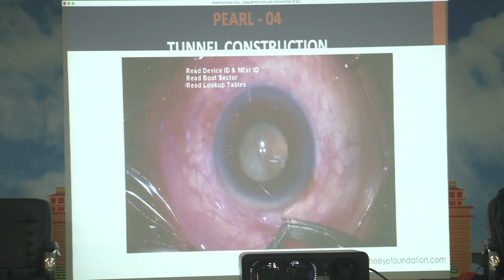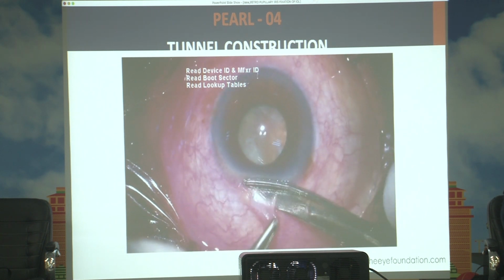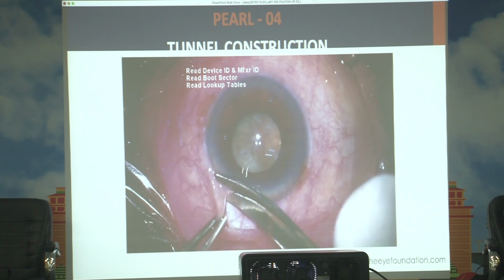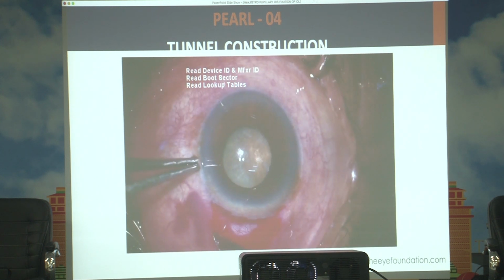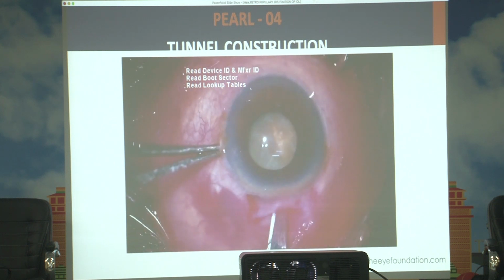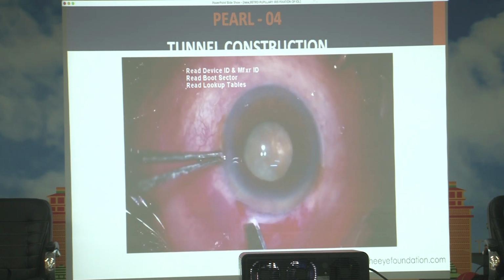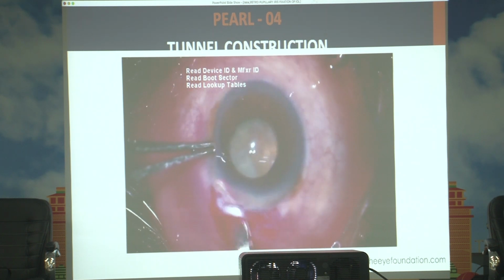Now, as far as the basic surgery is concerned, essentially you make your conjunctival peritomy, and supposing it's a situation like this, a very subluxated cataract, it's best to make a scleral tunnel and not enlarge the corneal incision, because from a 2.4 you would have to enlarge it to insert the 5 mm optic of the IOL. You would not make a superior tunnel if you think this patient might need glaucoma surgery later. You should make a thick enough flap, but not too thick that you have a premature entry, or too thin that you have a buttonholing.